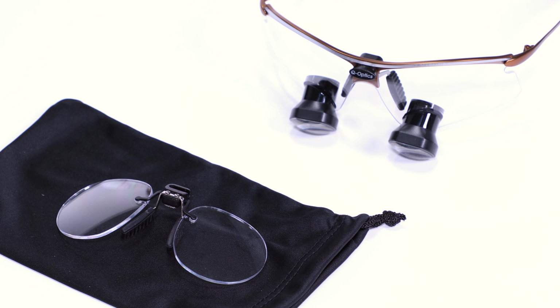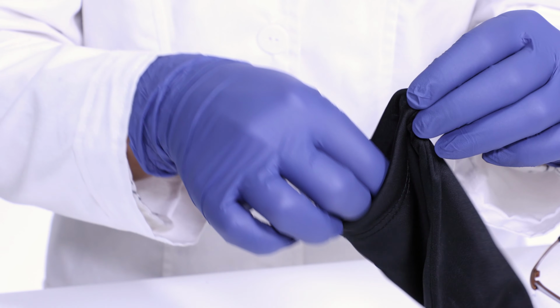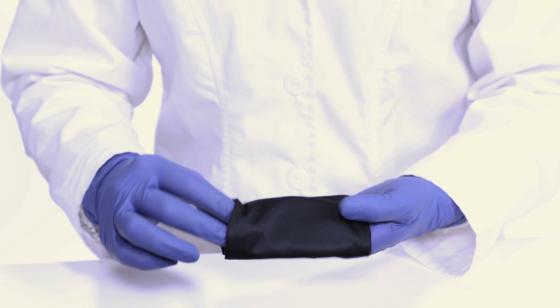When not in use, properly store the insert in the included satin bag to prevent scratches, along with your loupes in the case.